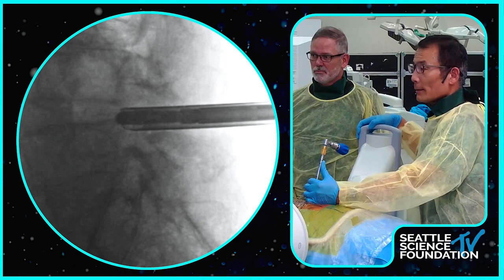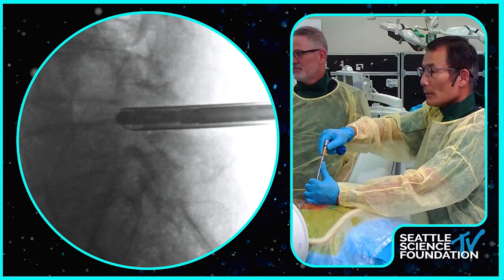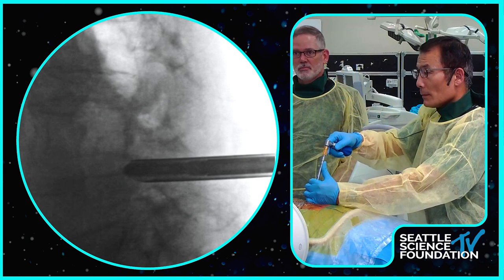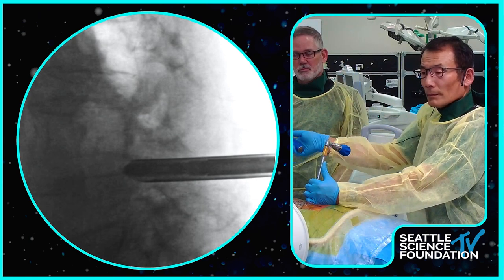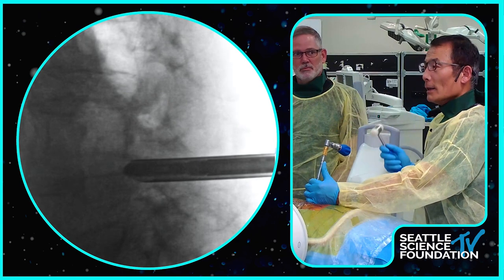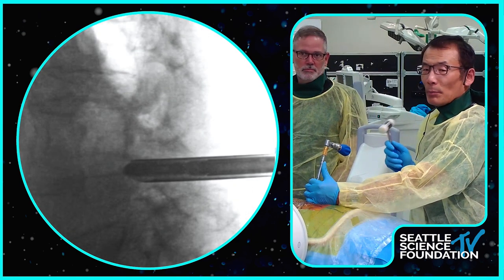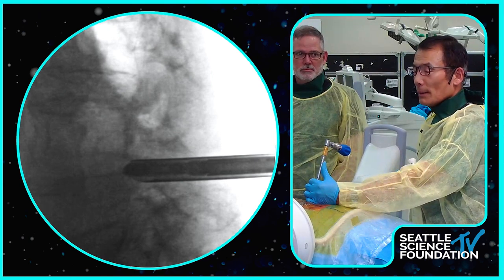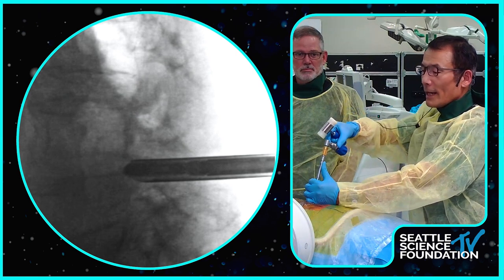So, Jian. Yes. So we all know that fusion's not just putting instrumentation, but biology and stuff. At what point do you suck out the fluid, put bone graft in there? Because you know, this implant can't post. Yeah, before I put an implant in for this implant, I always put an extra small BMP and bone graft anteriorly, before I place this cage.